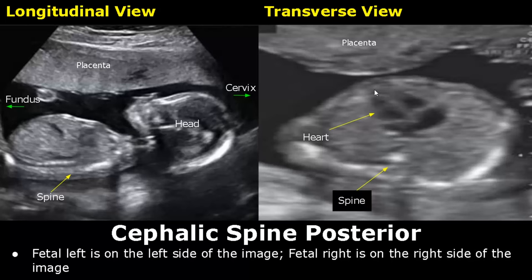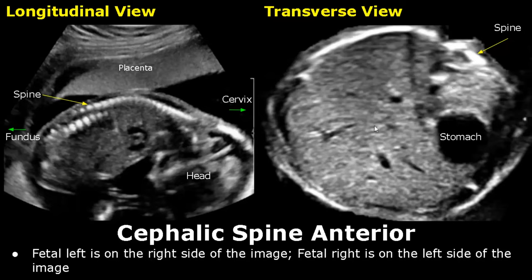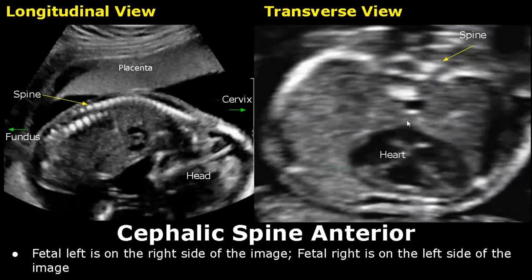The second orientation is cephalic spine anterior, where the spine is oriented anteriorly. In the transverse view, fetal left is on the right side of the image and fetal right is on the left side of the image. The spine is seen on the upper side of the image. Here is the stomach, so this is the left side of the fetus. And here is the heart — the apex is pointing towards the fetal left. The spine is seen on the top side of the image.